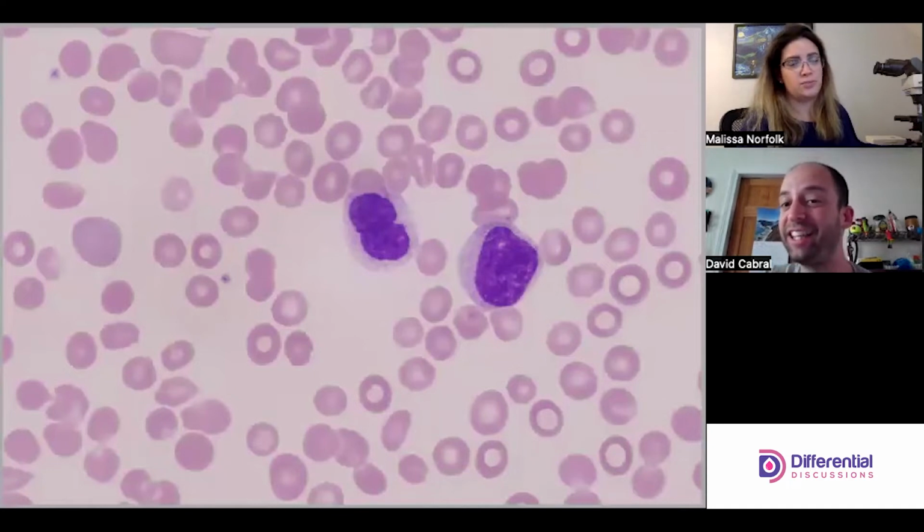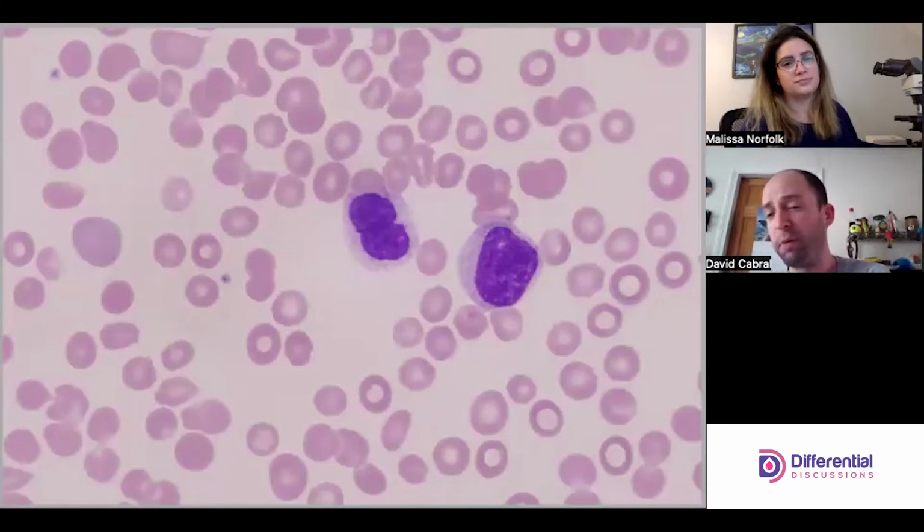Right. I think if we just took color out of the thing, this kind of looks like a pro size nucleus, and the cytoplasm, the NC ratio. Yes, it's more characteristic of a promyelo. Right. But the chromatin pattern is suggesting that it's more of a meta.